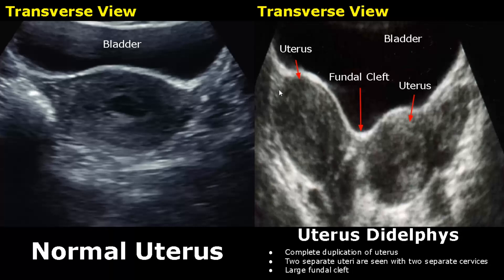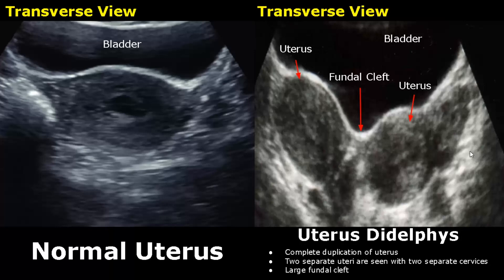Over here is uterus didelphys, in which there is a complete duplication of the uterus. We see two separate uteri with two separate endometrial canals. There is no connection between them. Also, there will be a large fundal cleft present at this location. The fundal cleft is seen better on a 3D ultrasound coronal image.